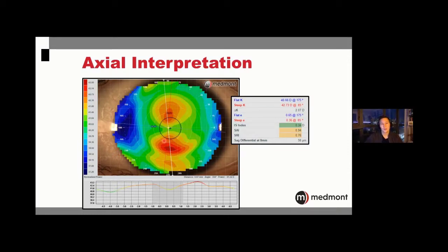But notice across the flat, there's this channel or this hole through the center that is kind of odd. You might look at these hotter contours and they kind of form these bumps in them. And we know that corneas are really smooth. Should the eye have these kind of sharp angles or these bumps in the surface, that kind of makes you suspect that something isn't quite right.